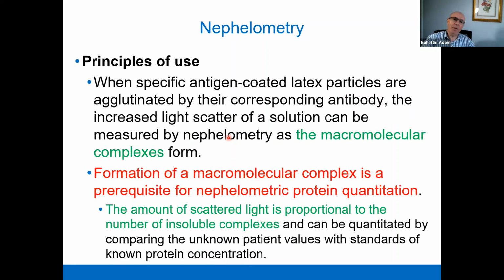Okay, the principle of nephelometry: when specific antigen-coated latex particles are agglutinated by their corresponding antibody. We know that usually antigens are soluble in the blood or other body fluids.